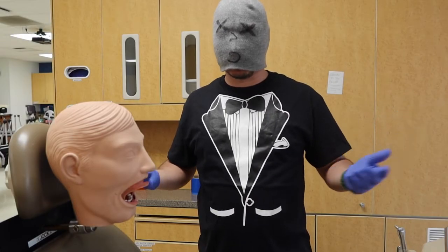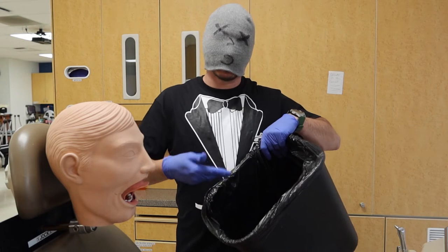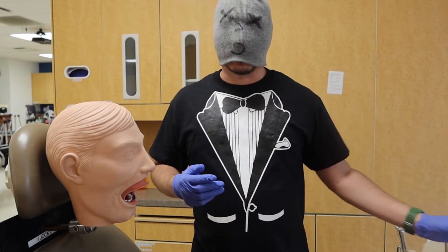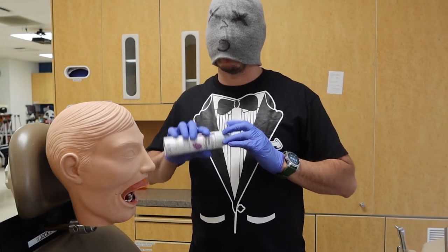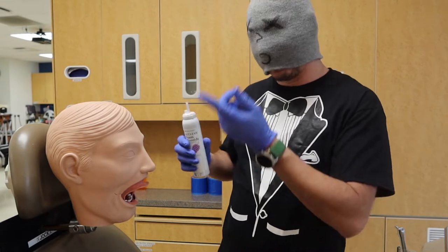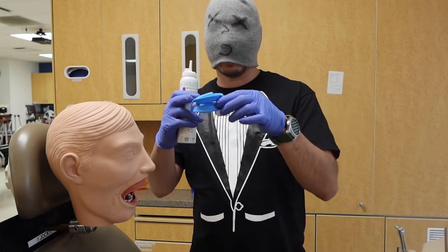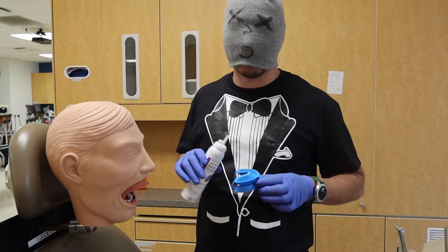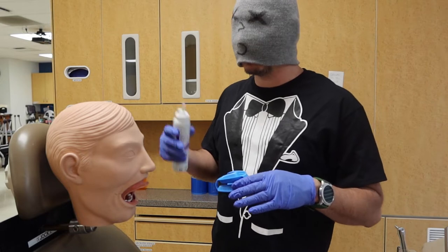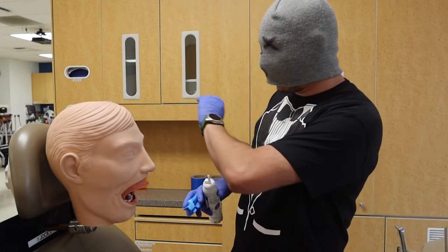Now that we are over here with our patient, make sure the sick bucket is nearby and ready to receive. We're going to get our patient all fluoride'd up with our tray material. Make sure we have our fluoride at the ready — give it a good shake for about 15 seconds or so. Now that I have the tray set up and ready to receive all my fluoride foam, remember to prep your patient: hey, don't swallow — make sure that you spit if anything's gathering in your mouth. You'll have that little suction to protect you for the next minute or two.